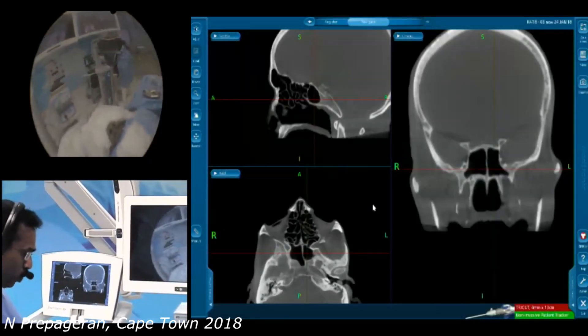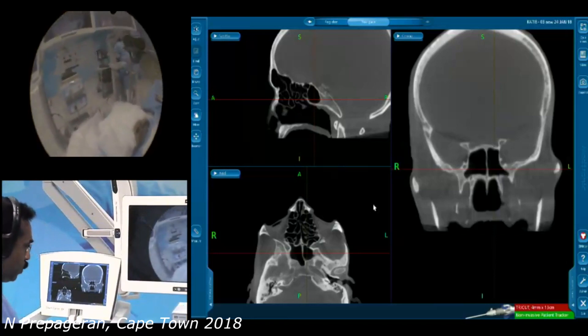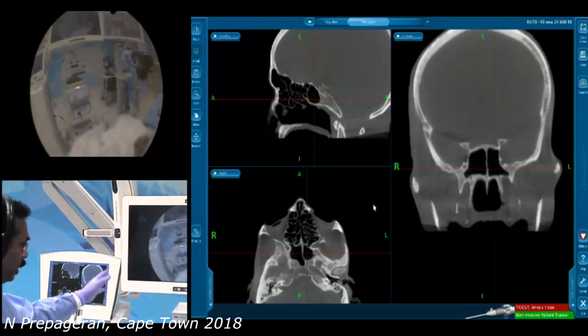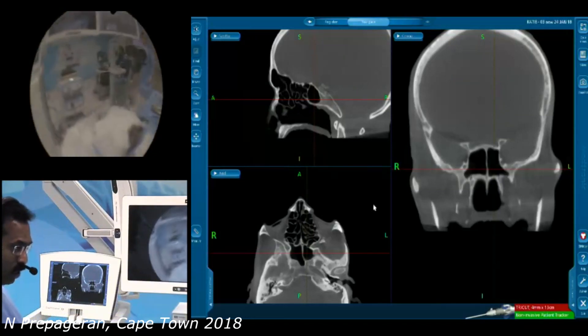Before we start, let me show you how we stand and how we do the surgery. We have the screen here, we have the IGS, and I'm fortunate that I have D to assist me.